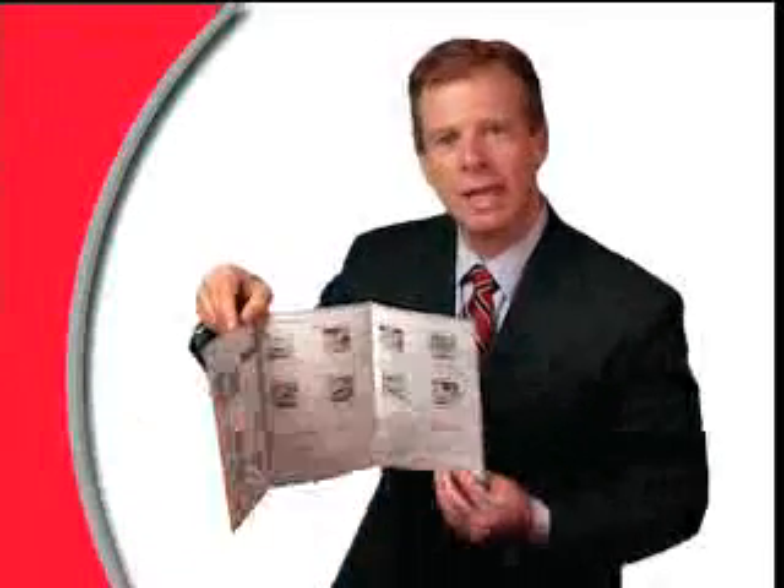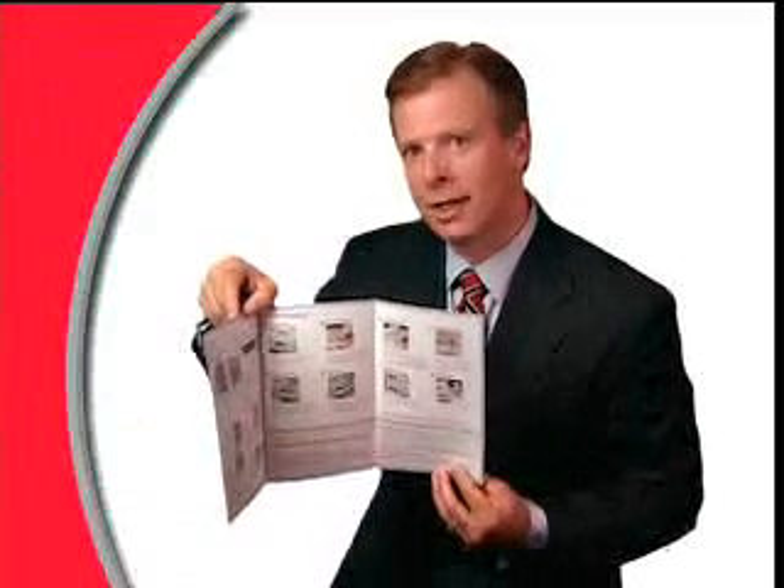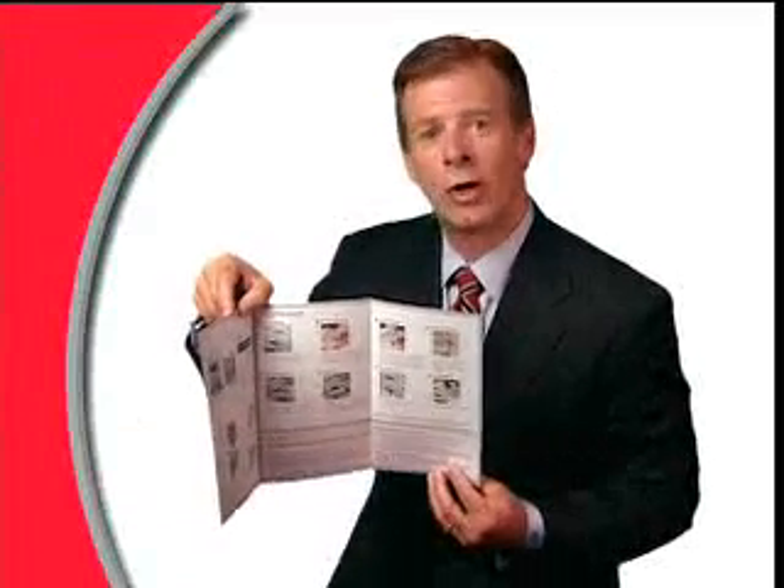A quick reference guide is also included with your LDX system. This guide shows you how simple it is to set up the system and run samples as well as to perform a proper finger stick. Let's get started.